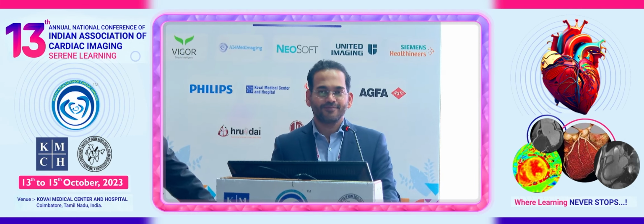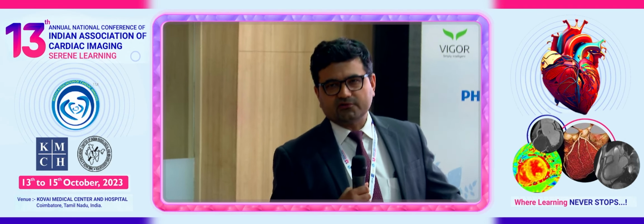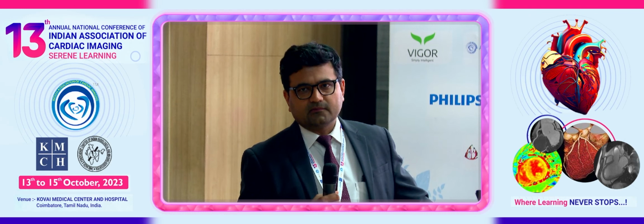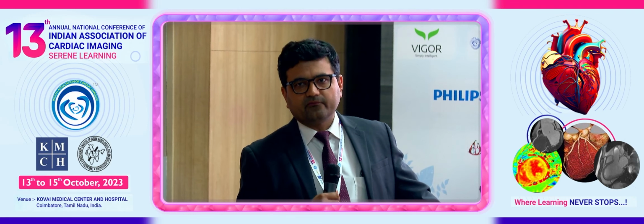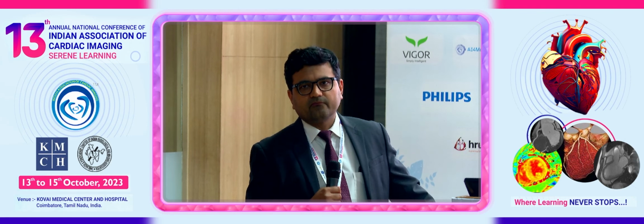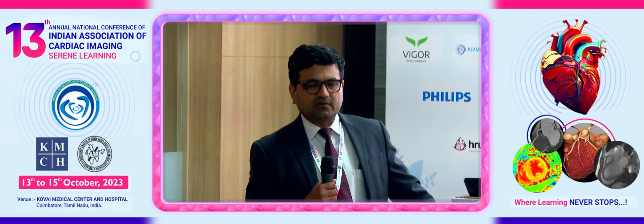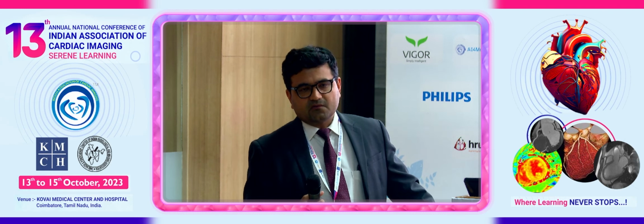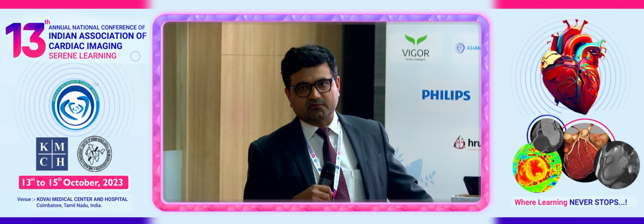We typically don't, and it depends on the temporal resolution of the scanner. I think a little bit of motion is tolerated, and usually it doesn't require repeating. If there is motion, yes. So again, it depends. Sometimes we end up repeating if images are so terrible, but I think that's too much to do for a calcium score CT.